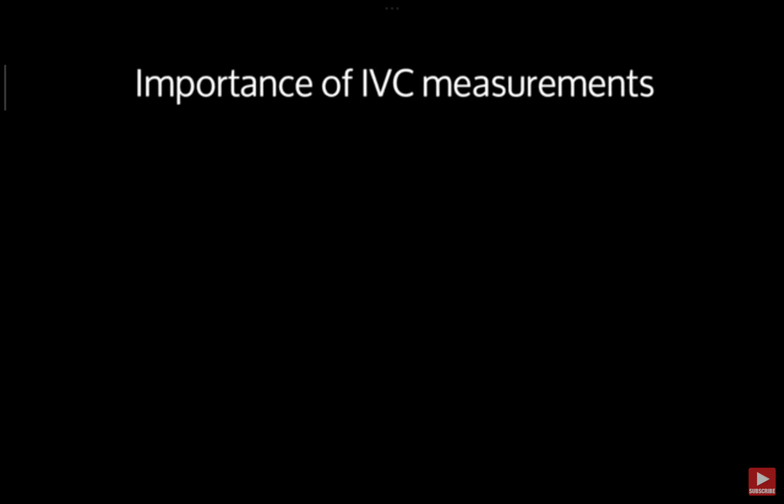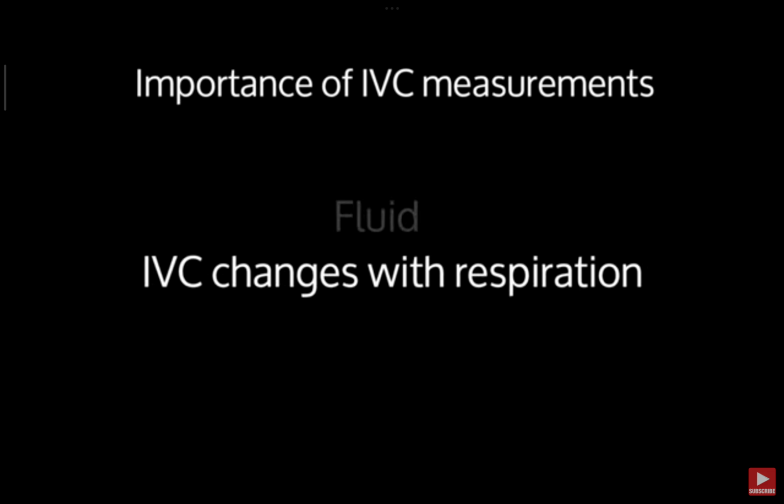Even though we talked about the 4 views of the heart, it would be prudent to also talk about the IVC, as this can help you gather more information that is very important about the patient's fluid status. In a nutshell, IVC measurements are important because they help guide fluid management. The respiratory cycles correlate with changes in IVC diameter in someone that can receive fluid, giving estimates of CVP. During deep inspiration, the diameter gets smaller, and during expiration, the diameter gets larger.